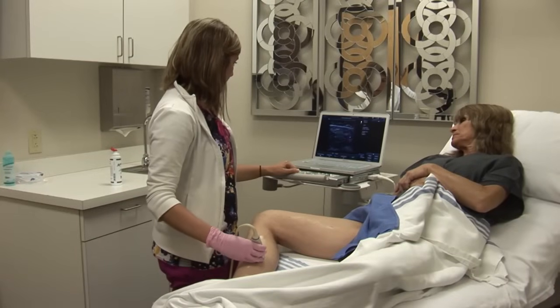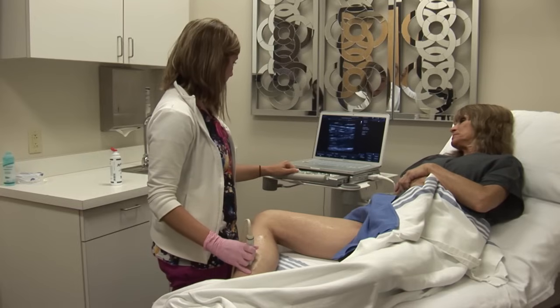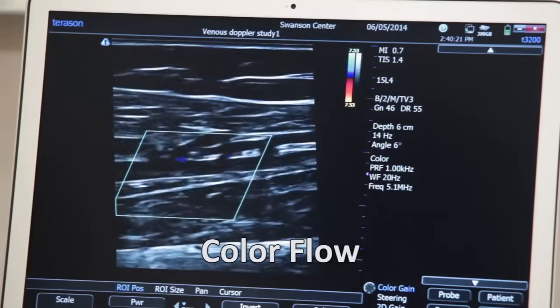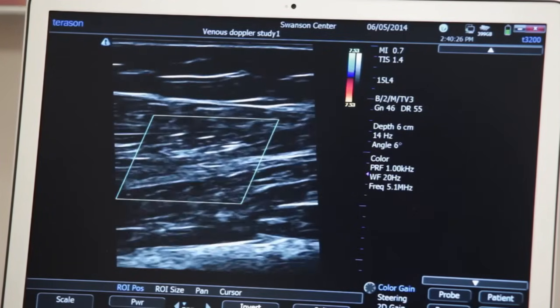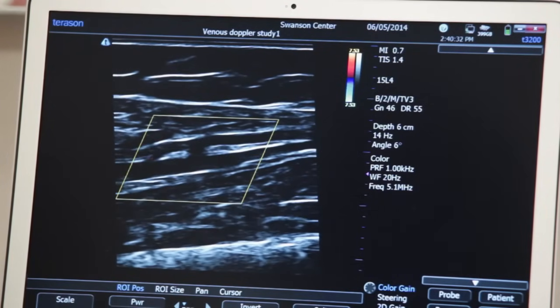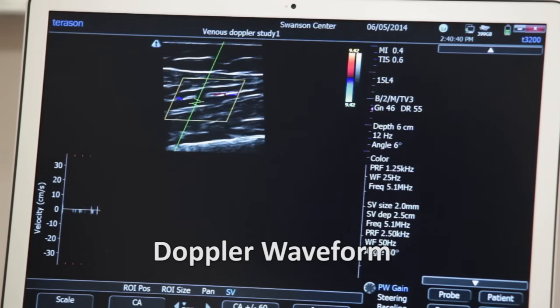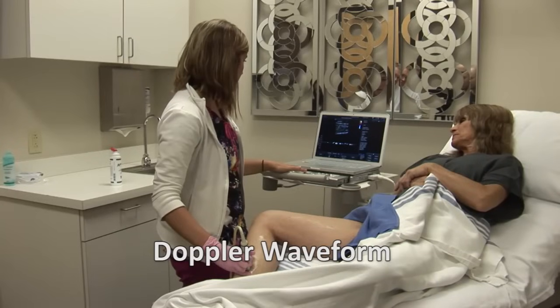Now that all my veins are compressing, I can start my color fill pictures and my pulse wave doppler pictures. We first make sure that the veins show nice color fill — the posterior tibial veins first. I'm going to turn my pulse wave doppler on, put my sample volume in the middle of the vein to get a nice waveform.